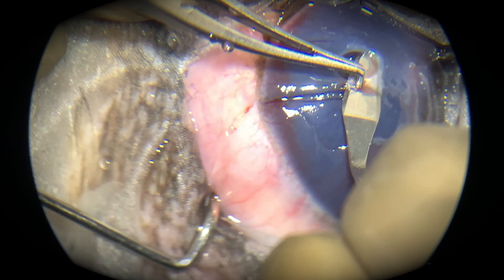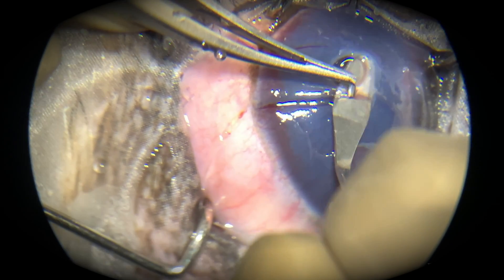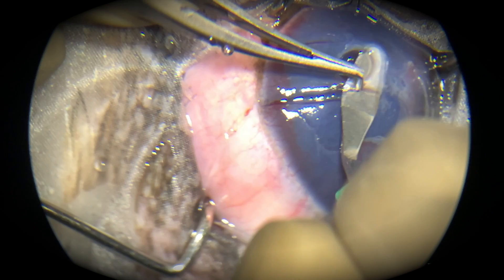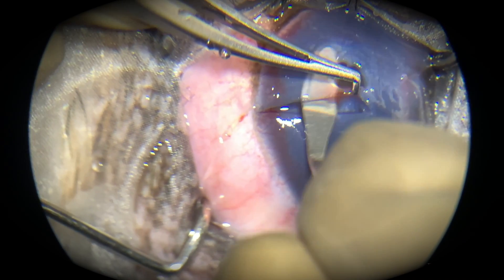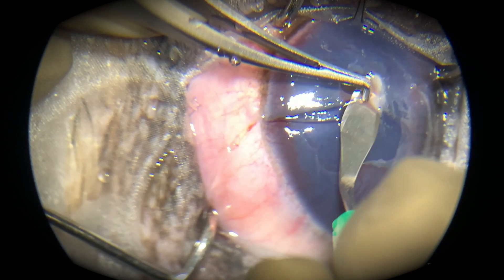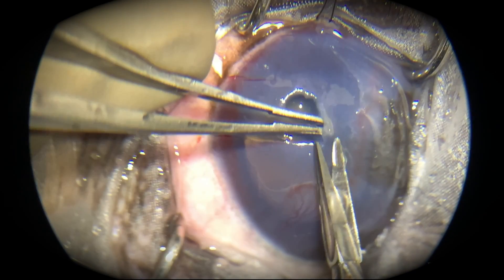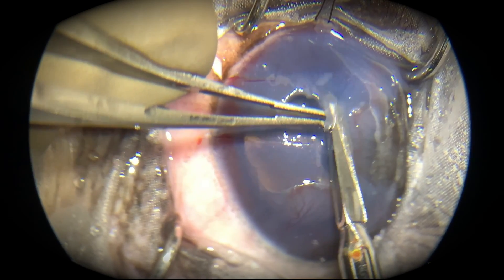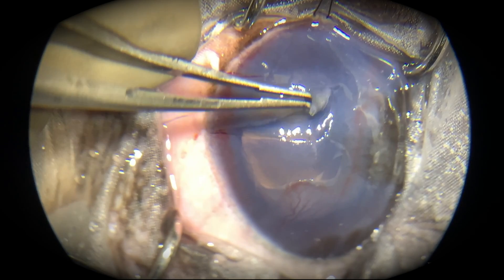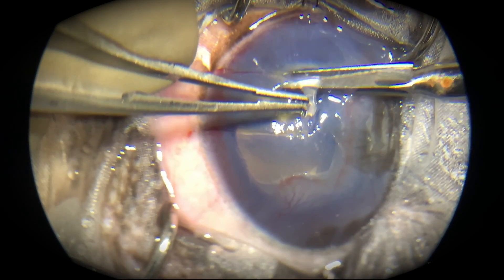This type of graft is called a sliding corneal graft, or corneal conjunctival transposition graft. We are using the corneal portion below the ulcer, towards the conjunctiva. We can't just slide that portion of the cornea forward on its own — we have to slide it along with its blood supply, along with the conjunctiva.